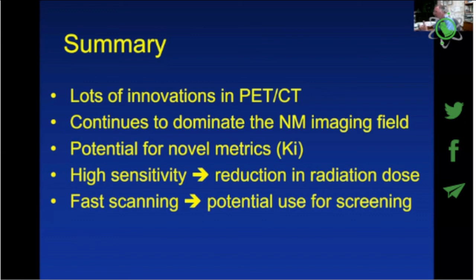In our institution, we do PET scans about 100 patients a day. On average, our PET patients take about 20 minutes. Hopefully, we are looking to get these large axial extent machines, and we should be able to do these scans in the order of about 10 minutes accordingly.